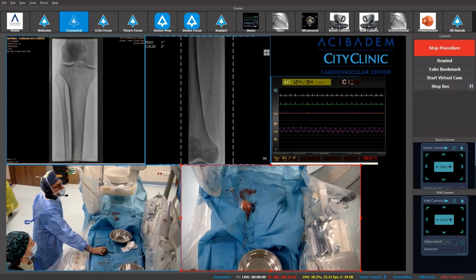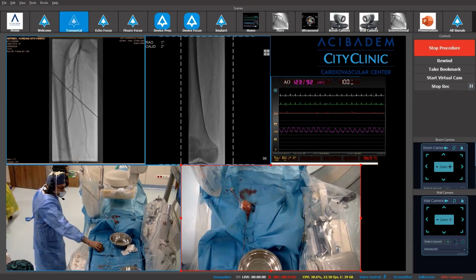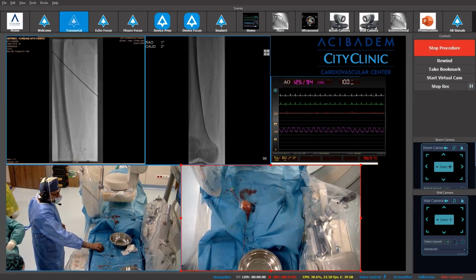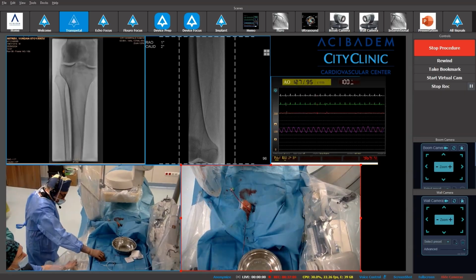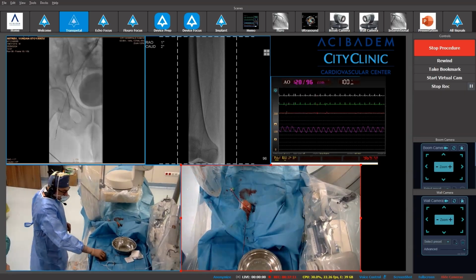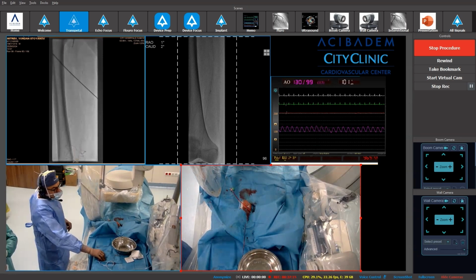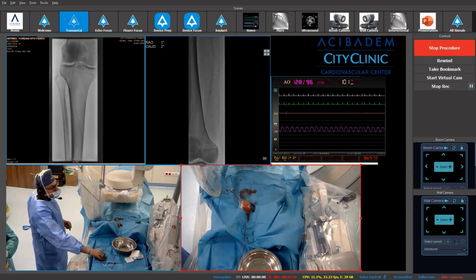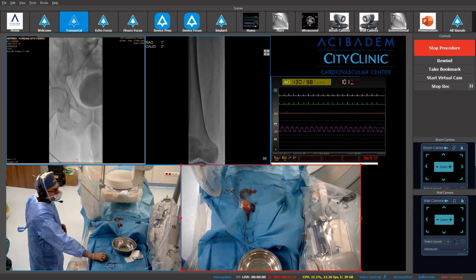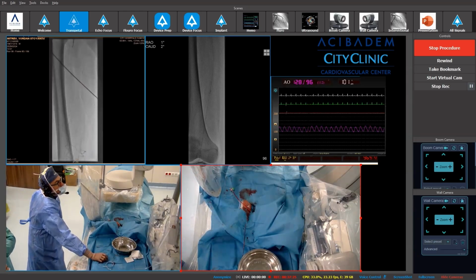Absolutely. Time of deflation. And speaking about contrast, our approach is always without any relation to creatinine and glomerular filtration. After reaching 100 milliliters of contrast utilization, we put bicarbonate in saline as a protection against contrast-induced nephropathy.